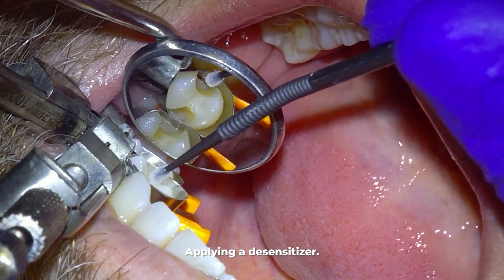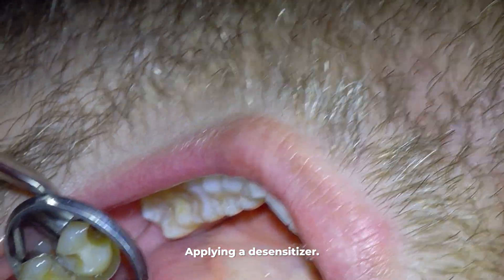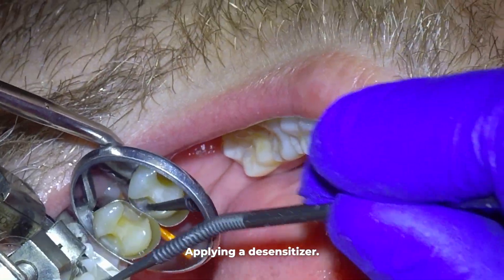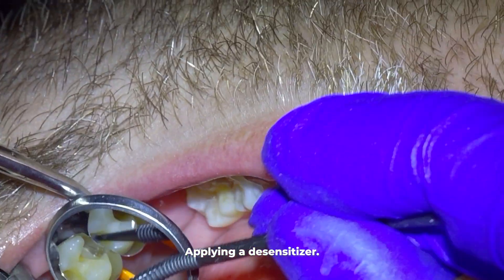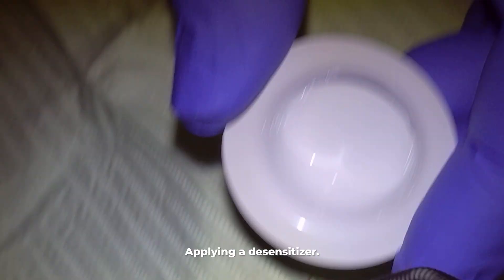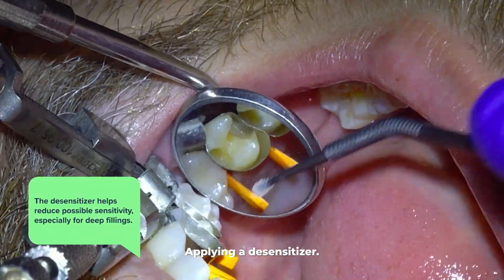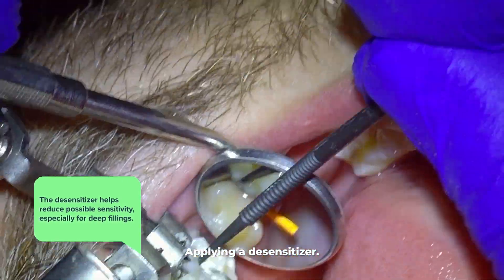The next step is applying a desensitizer to the tooth because we drilled down below the enamel layer. Anytime you drill past that enamel layer there's a possibility the tooth will become sensitive. This layer, called dentin, has tiny tubules connected to nerve endings, and the desensitizer helps reduce possible sensitivity, especially for deep fillings.